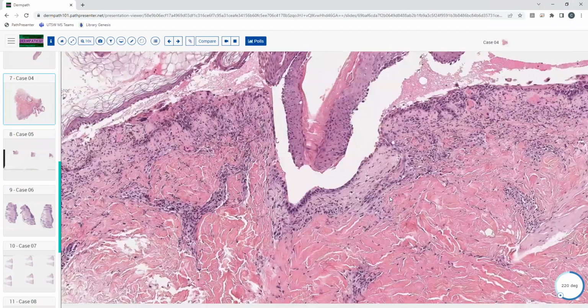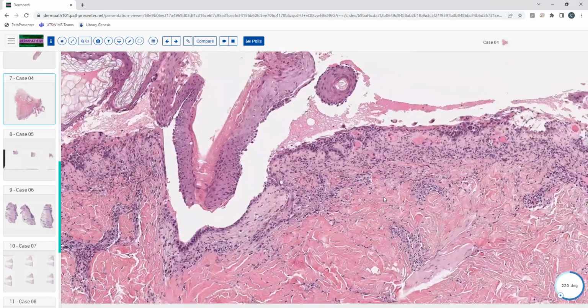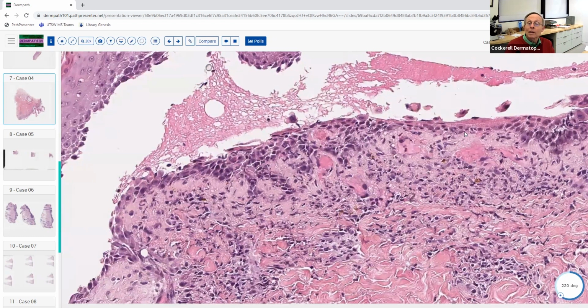Careful about that, because there's a way that you can be fooled in a subepidermal blister when you see epidermis here like this. Let's just say, for the sake of argument, that this is actually a subepidermal blistering disorder and not an intraepidermal blistering disorder. What's the explanation if we were to see a field like this? Are you going to say it's obviously intraepidermal blistering disease, because it's got this stuff and this, and therefore it has to be inside the epidermis that's causing the blister?